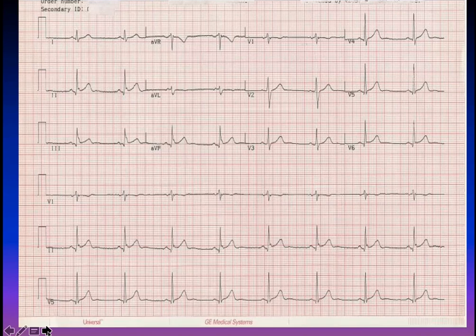Next, this is an example, no, of an ECG. In this ECG, you will note that there is a P wave. So this is sinus rhythm, and you count the squares. I'll compute the heart rate of this ECG. This is 5, 10, 15, 20, 25, so 25. So 1,500 divided by 25. So the heart rate of this ECG is 60. This is a 10-year-old boy, no? So we call it sinus rhythm because the heart rate is 60 and there is a P wave. So the interpretation of this ECG is sinus rhythm and the heart rate is 60.